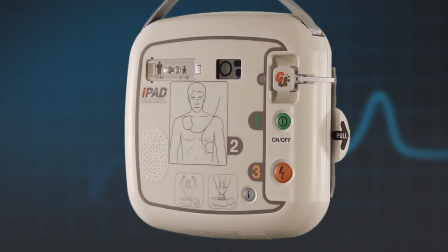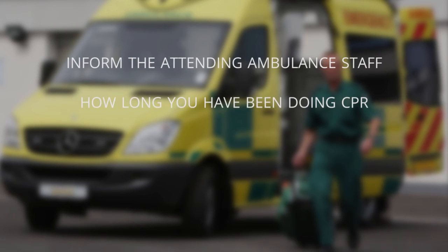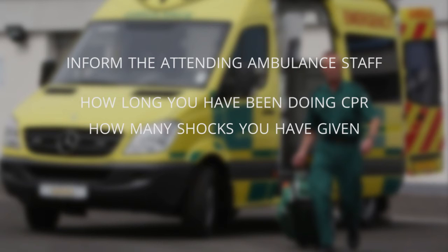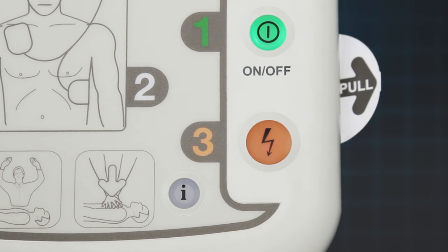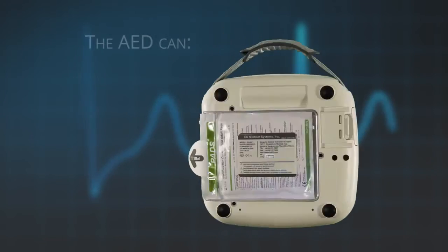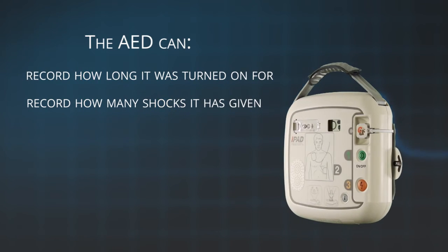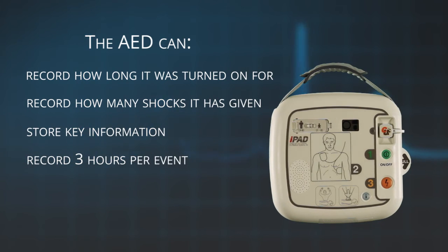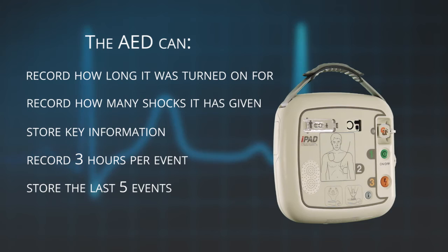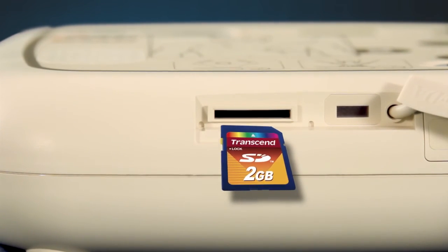If you have to use your AED, it is always important to inform the attending ambulance staff of how long you have been doing CPR and how many shocks you have given. This is easily done with the iPad SP1 by turning the AED off and then holding down the blue I button for more than one second. The AED will immediately tell you how long it was turned on for and how many shocks it has given. The iPad AED will also collect and store key information during an event — it will record up to three hours per event and store the last five events. The data can be retrieved using the SD card or infrared connection.